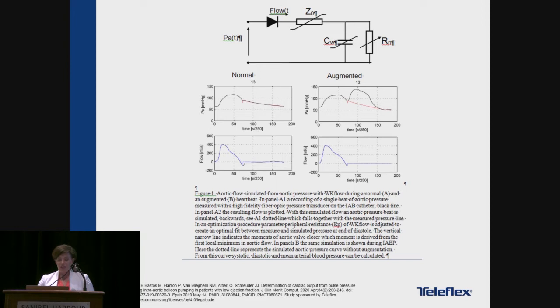In evaluating counterpulsation impact, though, a novel method has been developed to calibrate the flow wave for volume using the arterial pressure and to remove the inflation impact or augmentation from the volume calculation. In the left graph above, a non-assisted arterial pressure waveform and associated flow wave are shown.